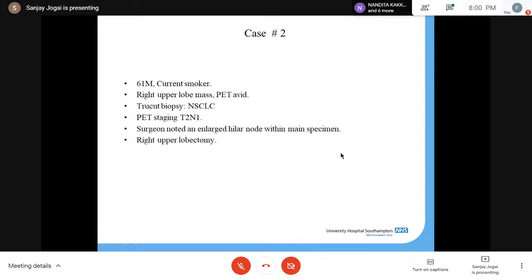If you are doubting something this small cell, don't get disappointed if the synaptophysin and chromogranin are negative. That is one area where CD56 is so useful. Exactly. Even in a completely crushed specimen, if you see CD56 positivity, the clinician can treat. Yes. So if there are no more questions, please take the next case.